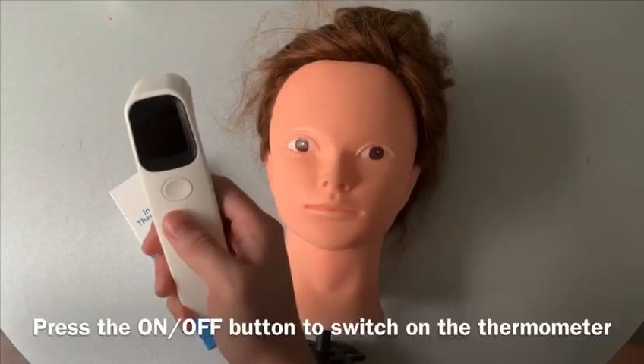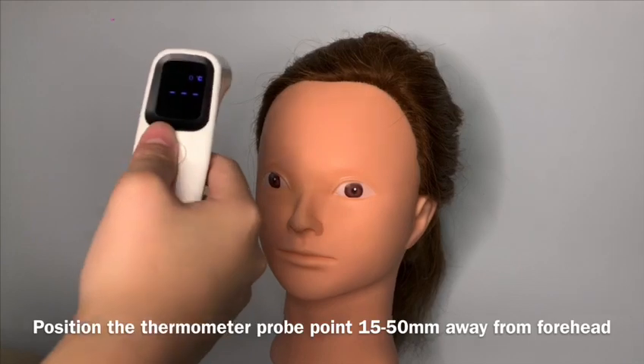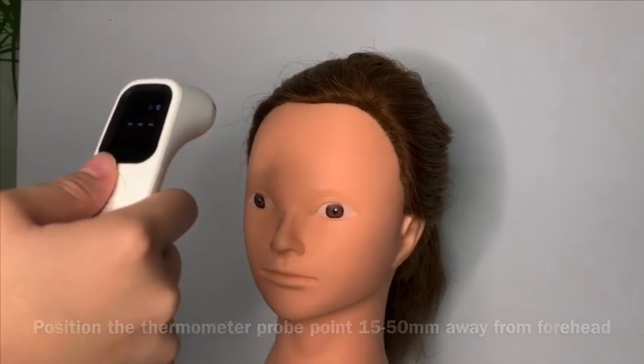To turn on the thermometer, just press the on-off button. Position the thermometer probe point 15 to 50 mm away from the forehead.